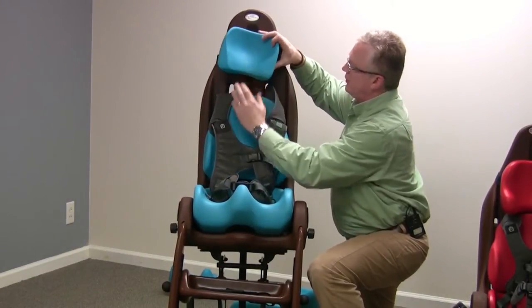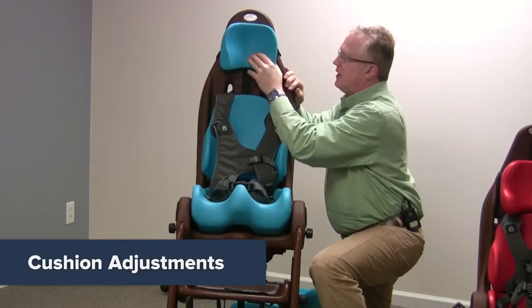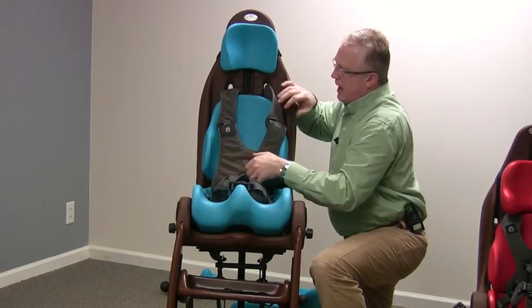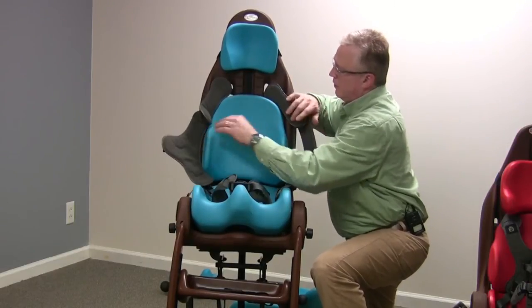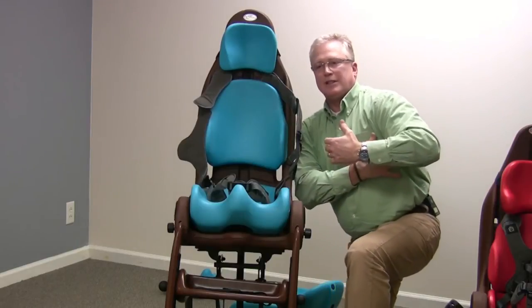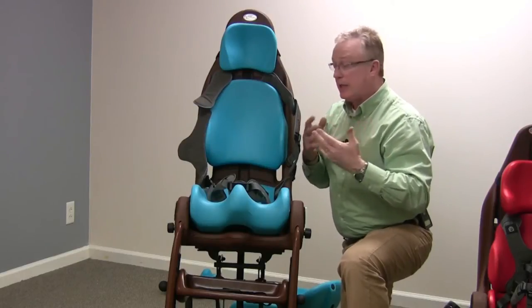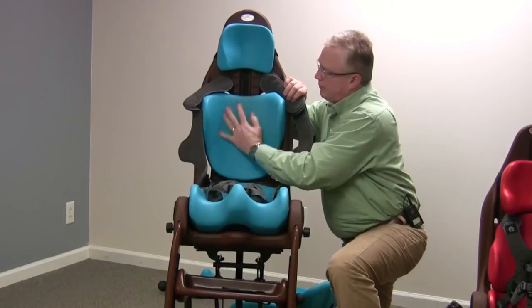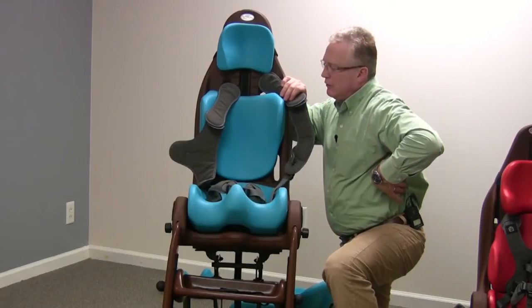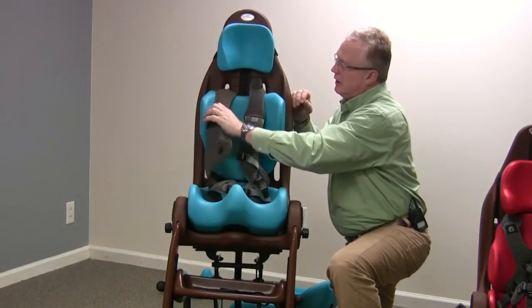The headrest, just like the back support, moves up and down on this track. So as the patient grows or as the postural needs change, you can move the headrest up and down. If you have somebody leaning to one side who needs extra lateral support, there is no right or wrong way with the MPS High-Low seating system. You can flip the cushion around and move those laterals up higher underneath the patient's arm or chest to prevent them from leaning to one side.